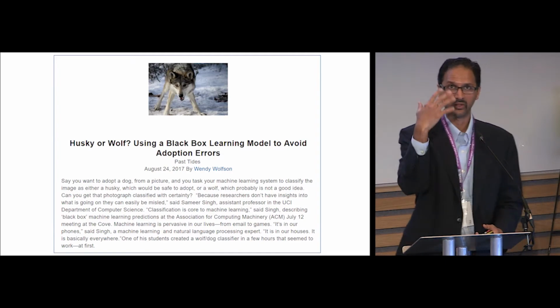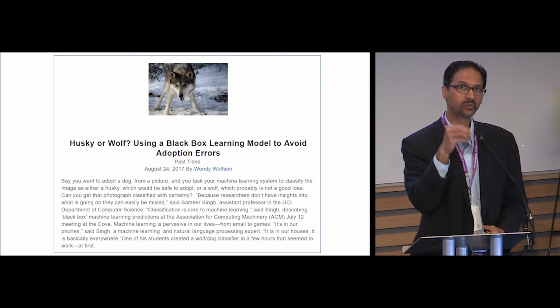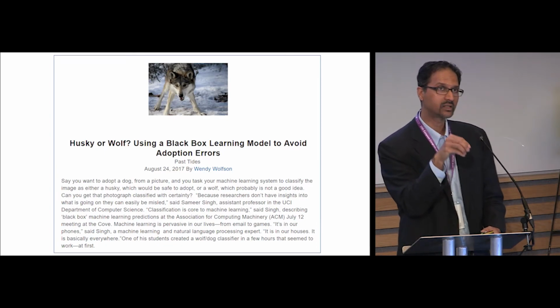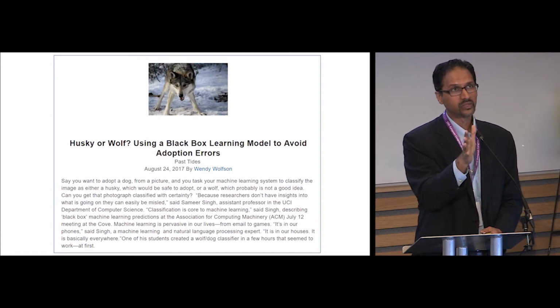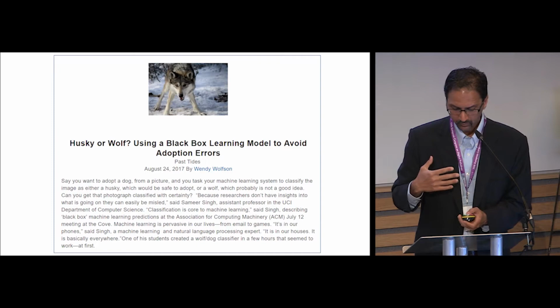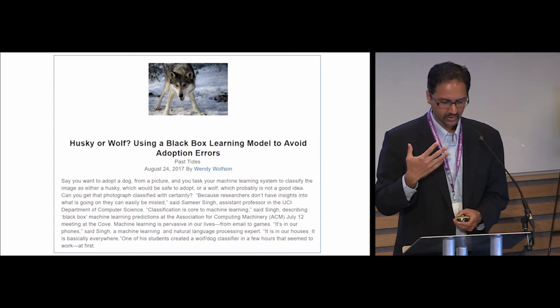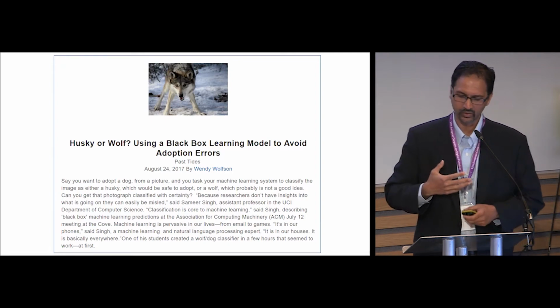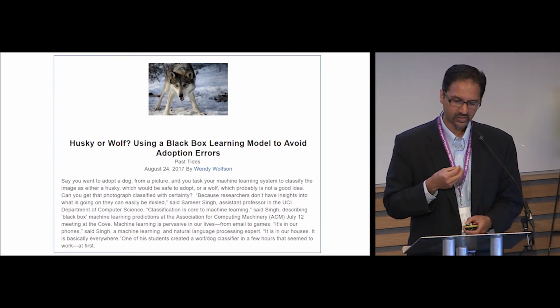It wasn't actually picking up features of the face of the animal itself. It was picking up patterns off the background, and it recognized that in images of huskies versus wolves, there was invariably snow, or there was something that was different about the background. And so this, I think, brings home the point that we really need to be careful. We need to be thinking about these approaches more critically, more systematically.